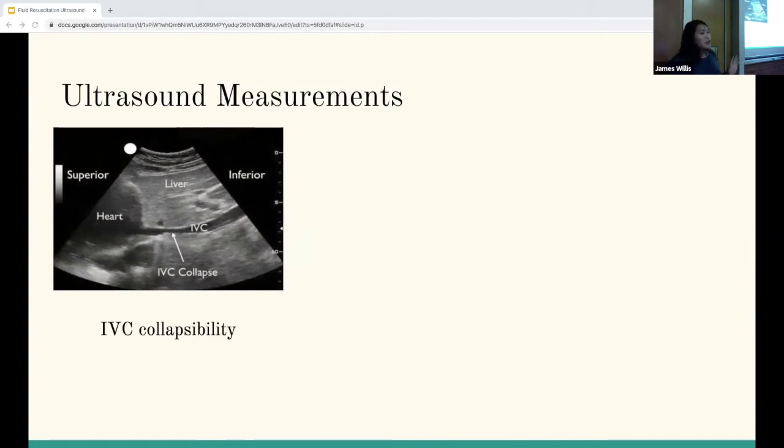From all the articles that I've read, if you have a patient with the perfect characteristics, without any confounding abdominal pressure or lung pressure, your probe is in the correct position, and by pushing the probe into the patient's subxiphoid area you are not also increasing their intra-abdominal pressure, you will probably get an accurate IVC collapsibility measurement.